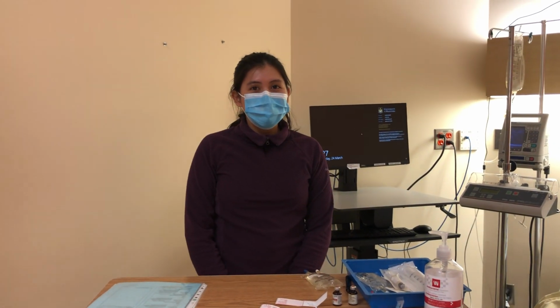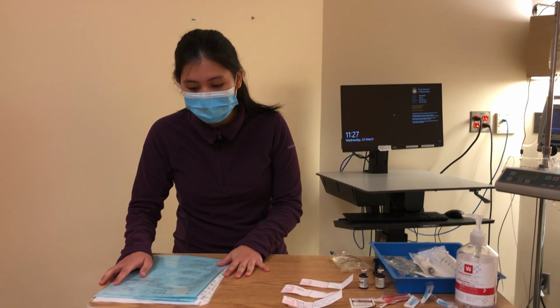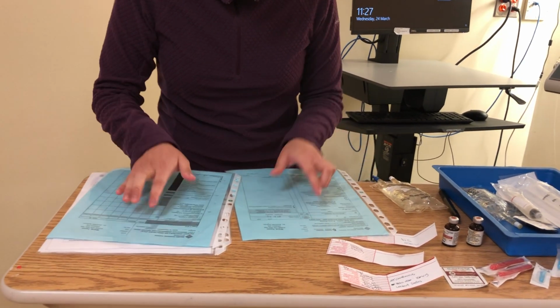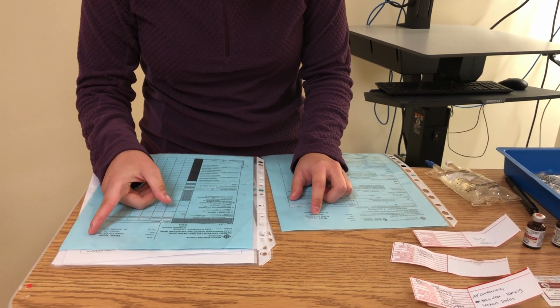Hi, my name is Alexis and I'm going to demonstrate to you how to administer medication via PCA Graesby pump. So first I'm just going to do hand hygiene and compare my physician's order with my MAR. So we have here patient Tyson Ward, PHIN number 123456789.